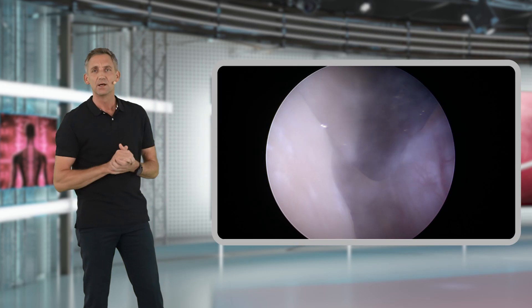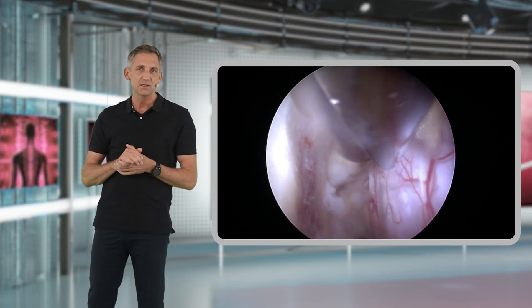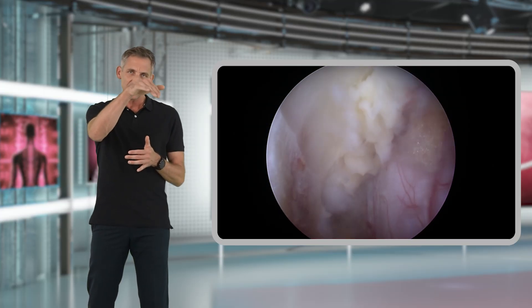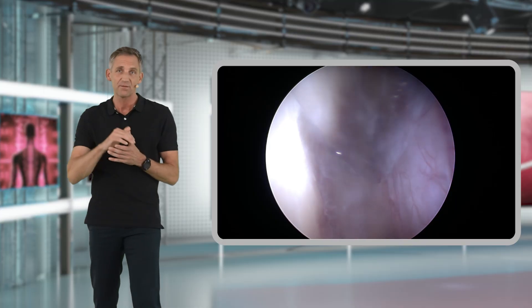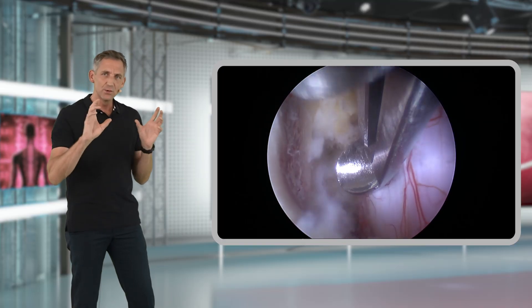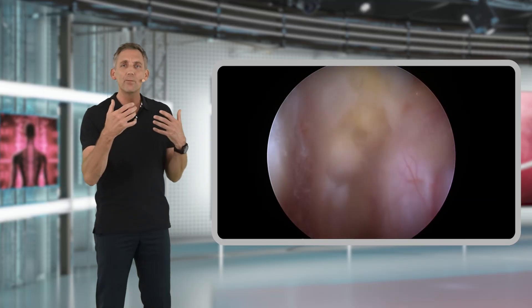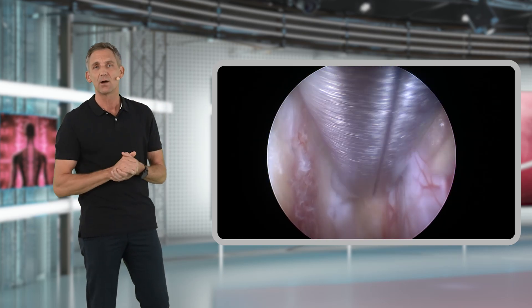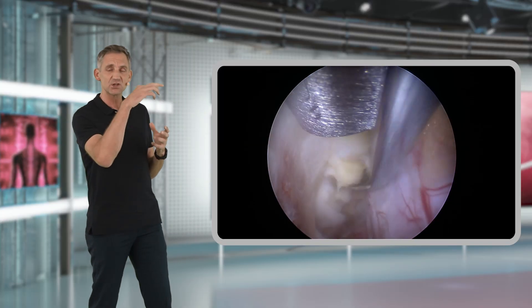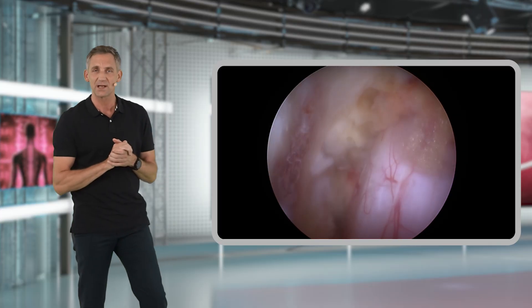You may encounter situations where the lamina and spinous process prevent you from going far enough contralaterally. In these cases, you may have to use the endoscopic high-speed burr to carefully resect the bone underneath the spinous process in the area of the lamina to reach far enough contralaterally. Only do this as much as needed, as there may be more bleeding in the cancellous bone, but once done it will be much easier to reach over the top and remove any remaining structures.